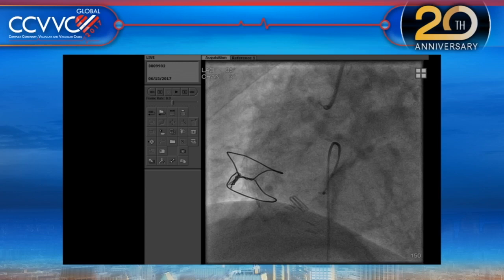No, this is fantastic, but this is a tough case. I do want to hear what the panel thinks. I know you have a plan. Take the opinion and let's have the panel talk about that a little bit.